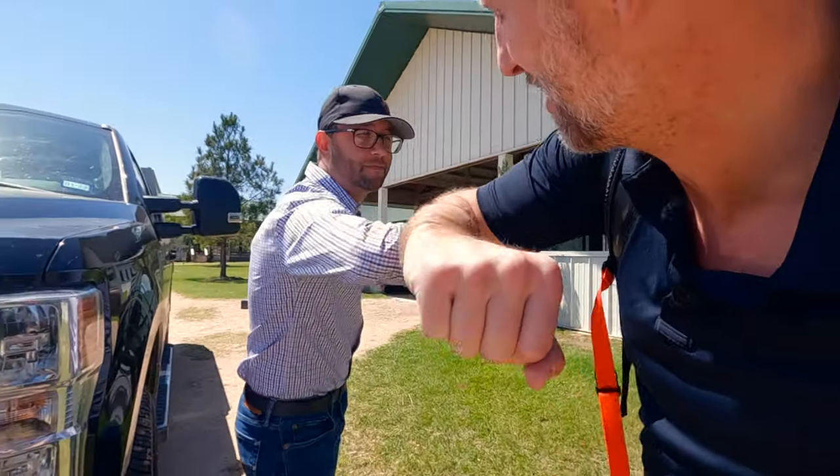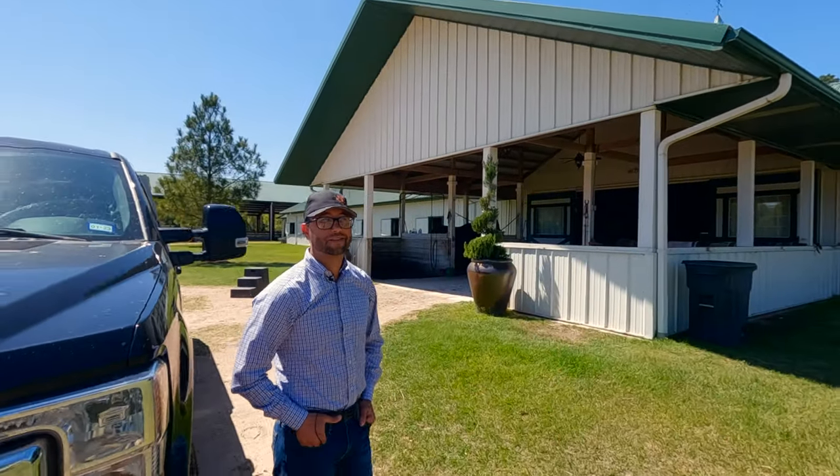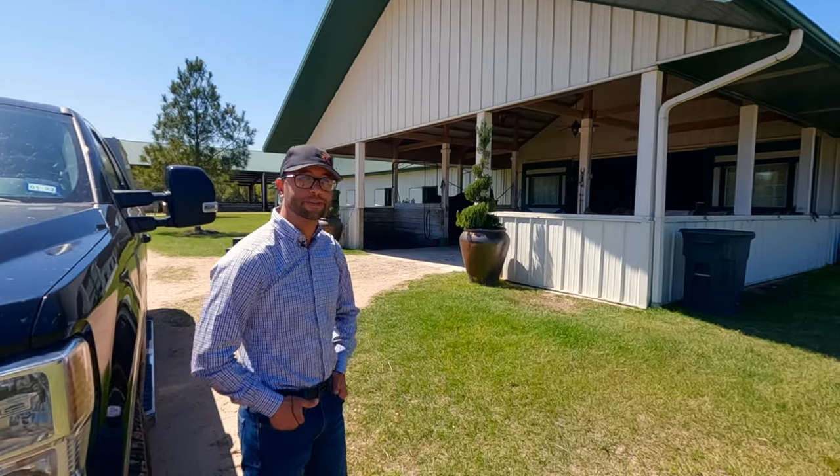Hey, how's it going Clayton? Come in here and meet him. Let's do an exam on him.